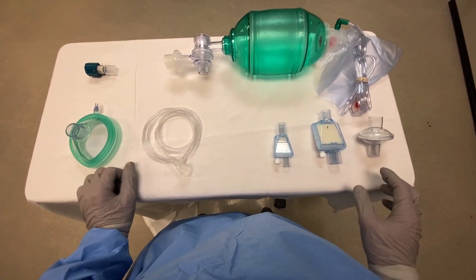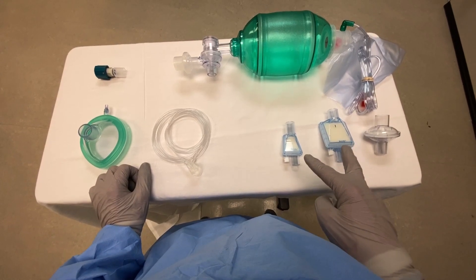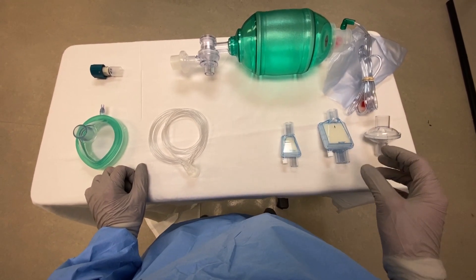These are three viral filters, two different brands. These two have a bonus humidifier in them. We can use any of the three.